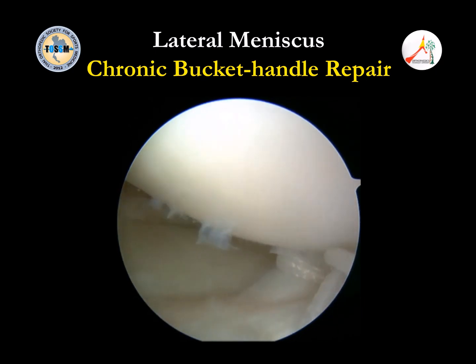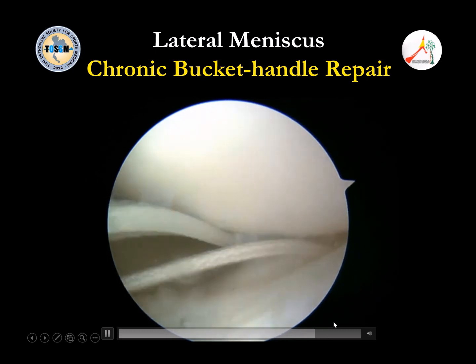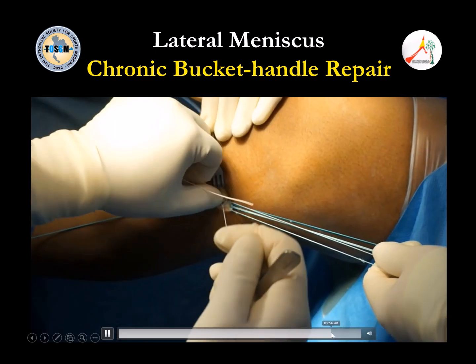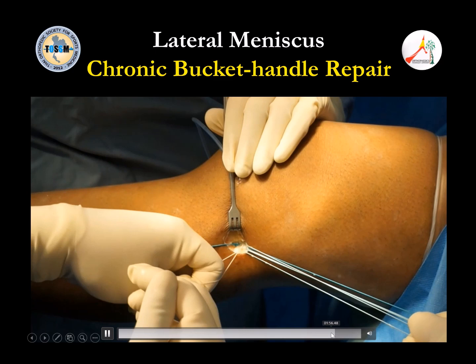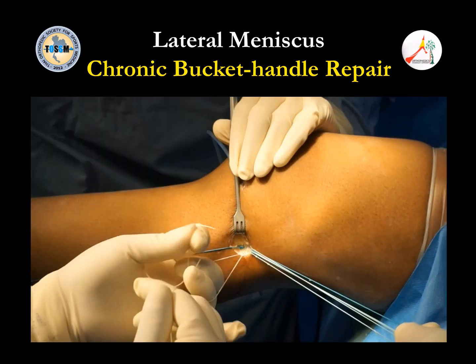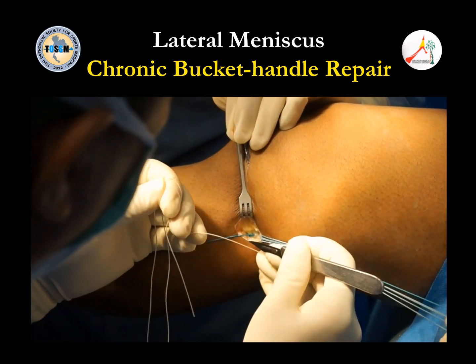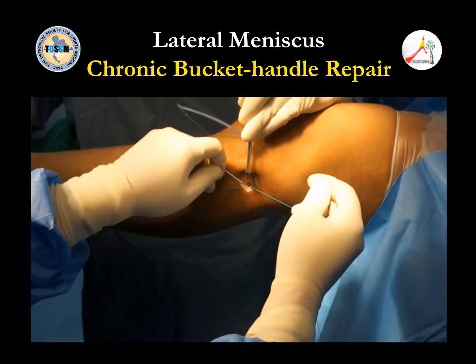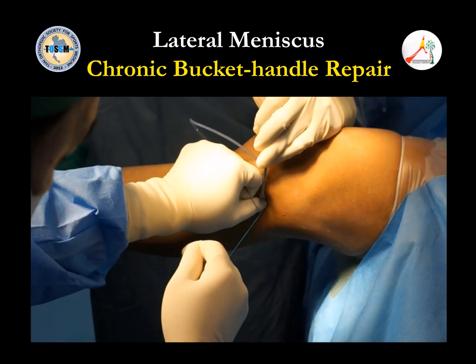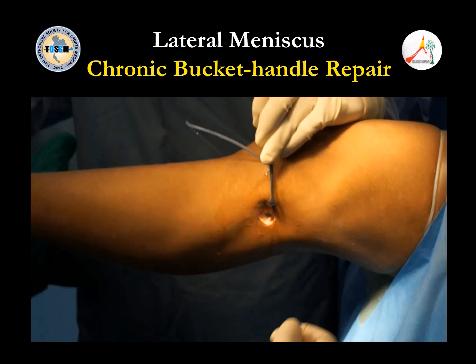Now finally we can reduce this meniscus back and immobilize the knee in full extension. Then we open the lateral side with just a small skin incision and tie the suture close to the capsule. On the lateral side there's the IT band, while on the medial side there's no IT band. Sometimes you need to open the IT band and repair the meniscus underneath it. It's quite different from the medial side.